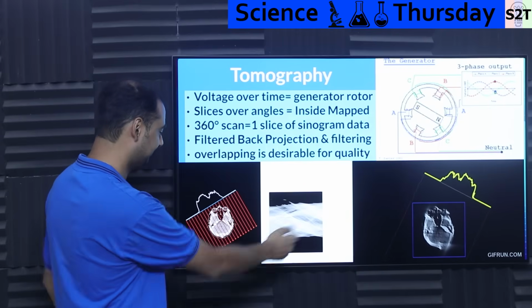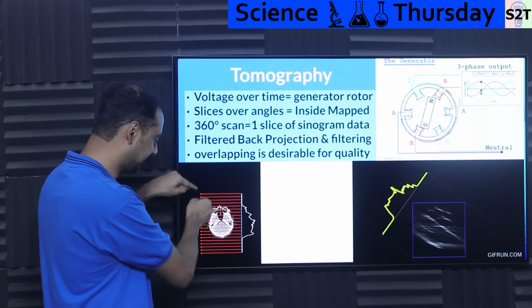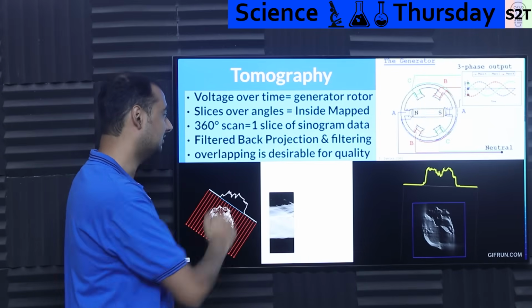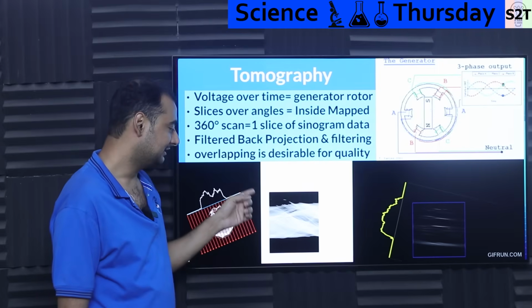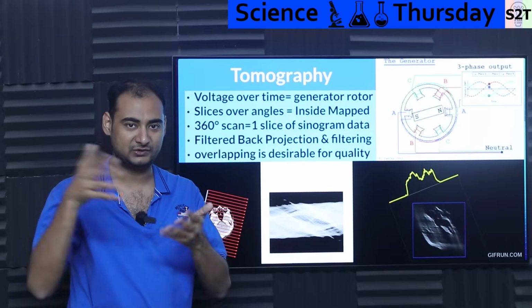You get this puppy. Basically, you have an object, you have X-rays going through it from the X-ray source, and you have a detector. So what is the detector reading? The detector is reading this, which we call a sinogram. It's exactly like sinusoidal, sinogram. Now, I'm reasonably sure I do not have to explain that this does not make sense. It's just white squiggly lines.